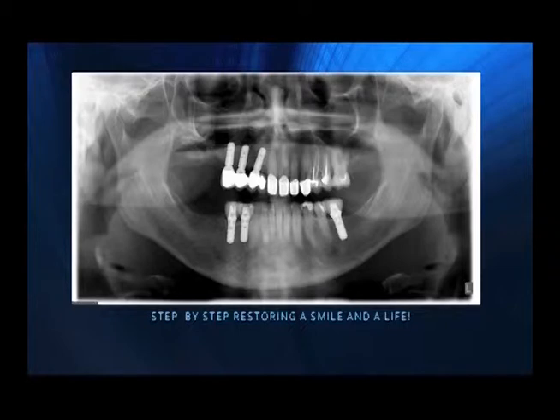And then on her wish list, another step-by-step process leads us a few years more to get some more implants so that they have great support all the way around in her mouth. She has great posterior support now so that it's not so waning on her anterior teeth, and she has a great functioning bite that is working out really well for her, and she couldn't be happier with her results.